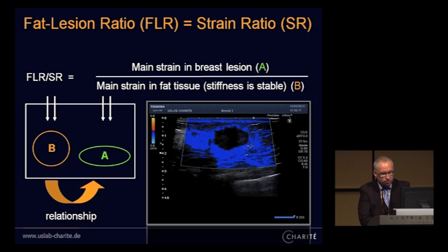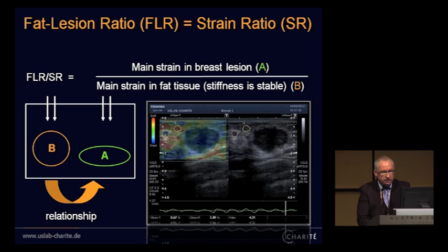This is a vibration elastography, which is named tissue Doppler imaging. And if we look very carefully at this image, that's a clear lesion, that's clear, but here's a small nodule. And now you can analyze this small nodule based on strain ratio quantification, and we see there's a high strain ratio value of 4.31, and the meaning is this is suspicious. This is typical for a small satellite nodule, and of course this is important information for the surgeon because now you have a greater lesion in size.